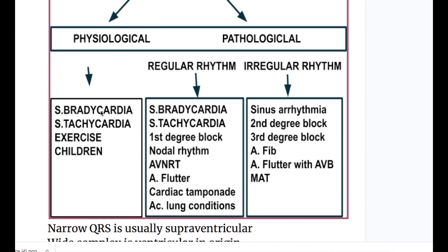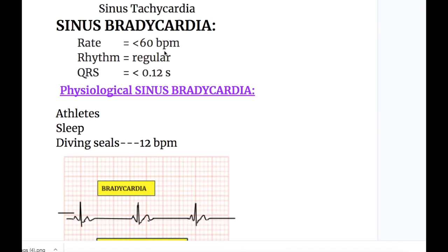First in the series is sinus bradycardia. In sinus bradycardia the rate is less than 60 beats per minute, whereas in sinus tachycardia the rate is more than 100 beats per minute. The rhythm is regular in both, and the QRS complex is less than 0.12 seconds. Both sinus bradycardia and sinus tachycardia cause a decrease in cardiac output.